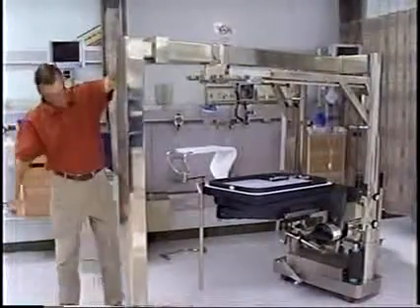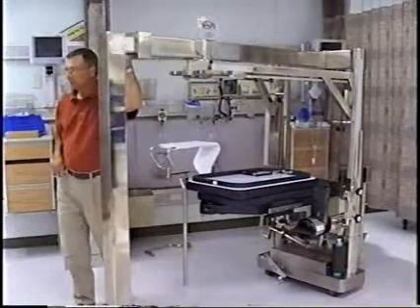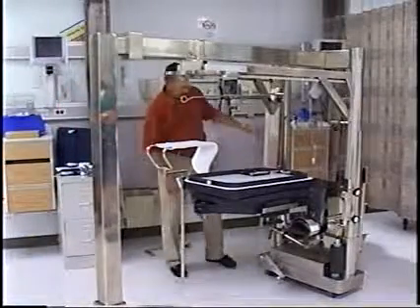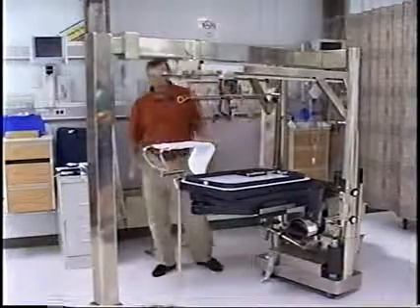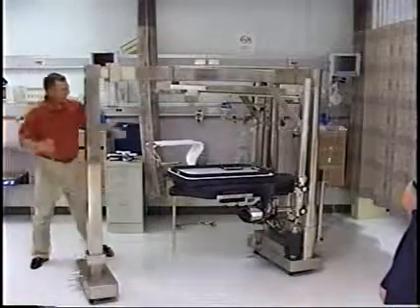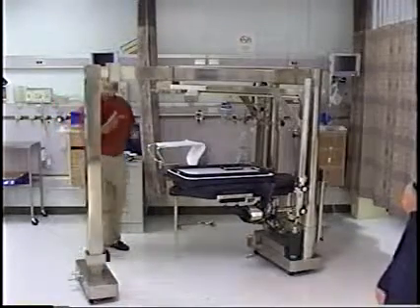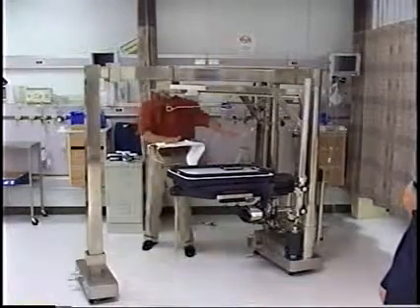Okay, once you've done that, the floor space that this takes up is no larger than your stretcher. In fact, it's probably smaller than your stretcher. So once it's in that configuration, you can take it back to wherever you put it and store it. The next time you have a case, all you do is expand it, pump it up, pull everything out, and you're ready to go. Provided it's a left. If it's a right, everything just gets reversed. The only thing that gets reversed is your well leg support and your traction device.